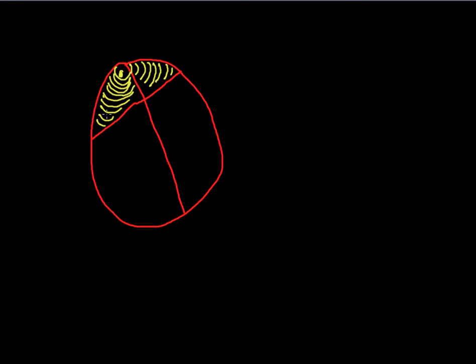And what we have is the blood is getting pushed here from the atria down through the tricuspid and bicuspid valves into the ventricles. So this takes place first. Now, I start out and I have a nice flat line, no electrical activity is taking place, and then I'm going to see this little round hump. So I see just that one little bump that's up there. Let me get the cursor out of the way. All right. So I see that one little rounded hump that takes place.